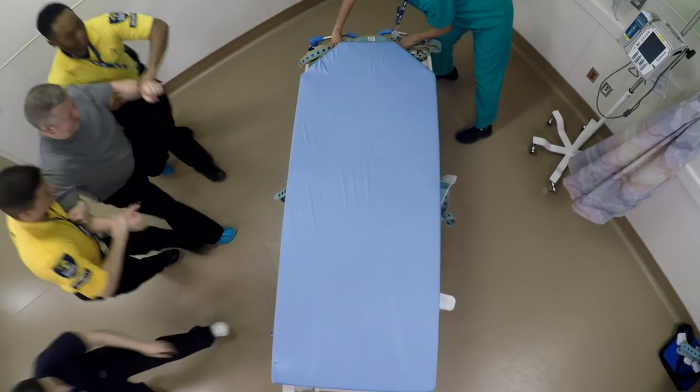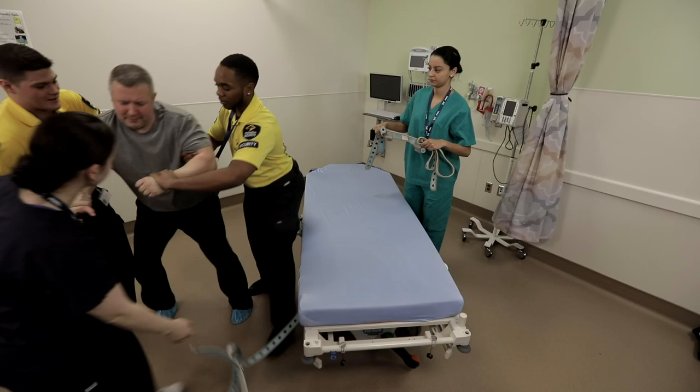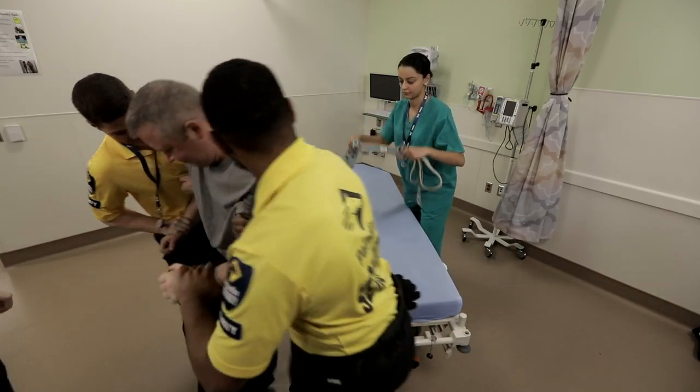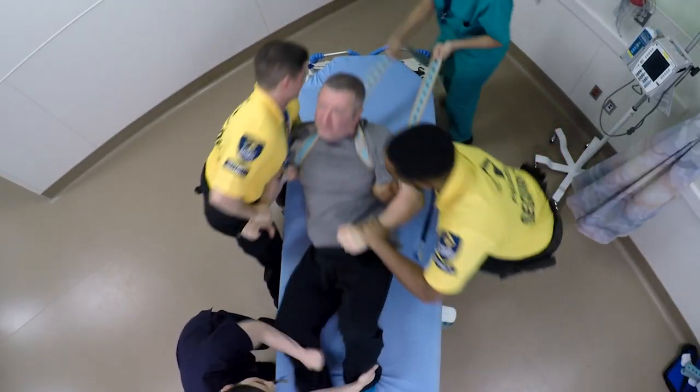When the decision is made to physically restrain a patient, you are facing one of the most dangerous and unpredictable events experienced in the hospital. You must work as a team, with each member focused on their responsibilities.